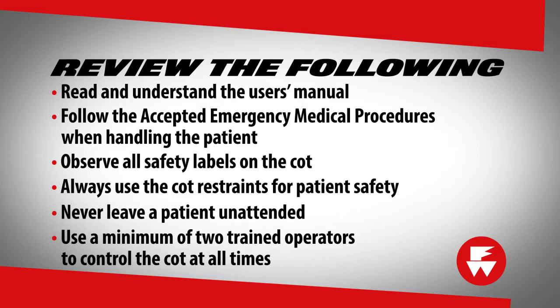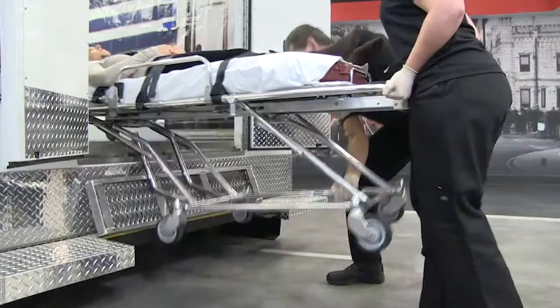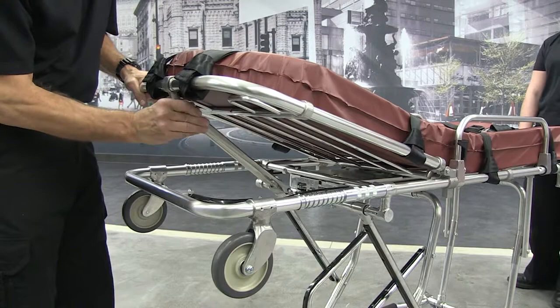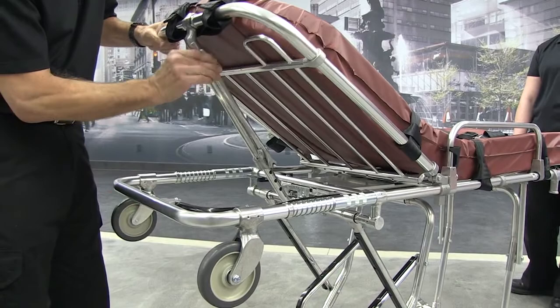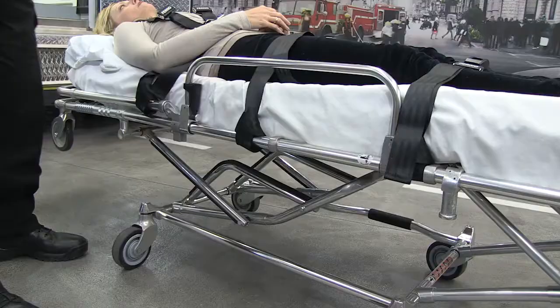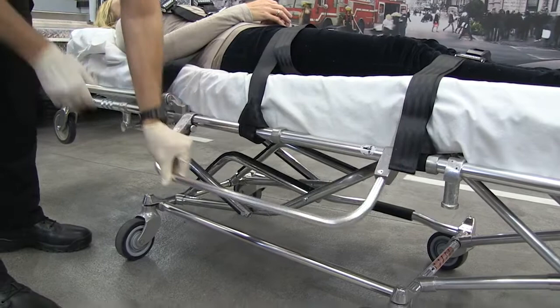Use a minimum of two trained operators to control the cot at all times. The 93ES Squad Mate features roll-in loading, which eases the physical requirements of lifting. An adjustable backrest provides eight positions for patient comfort and medical treatment. The fold-down frame, when coupled with a raised backrest, shortens the cot for maneuverability. The cot has swing-down side rails.